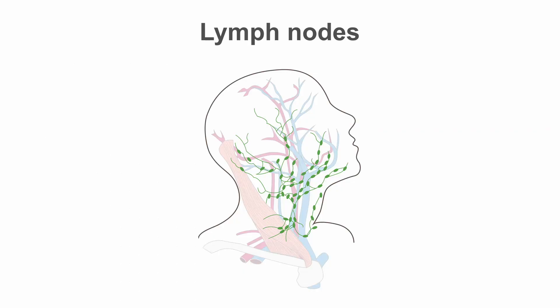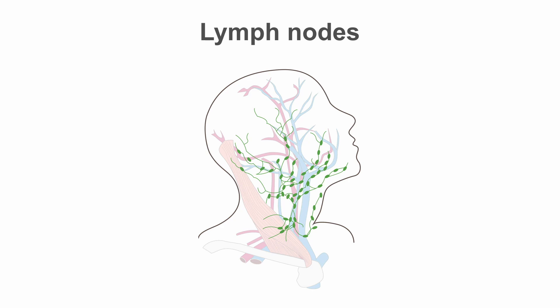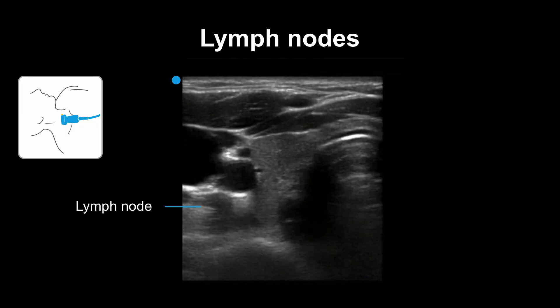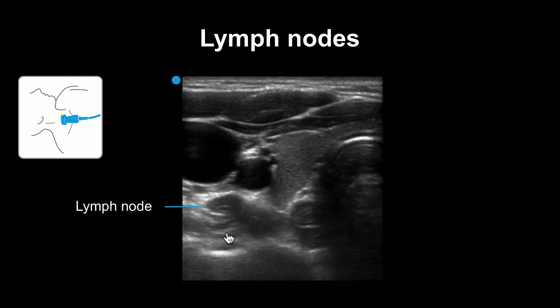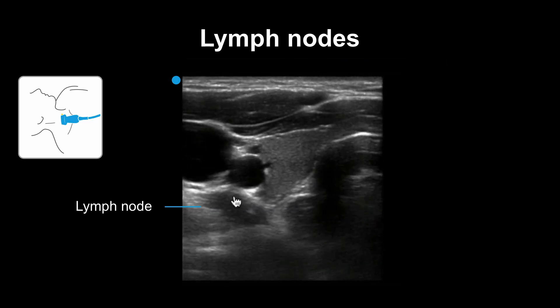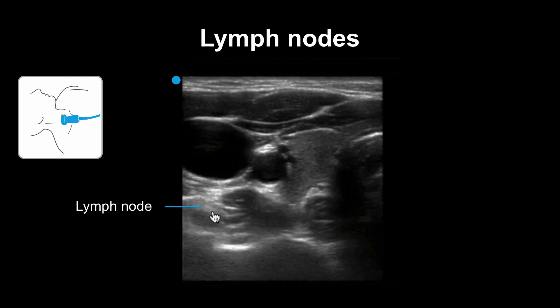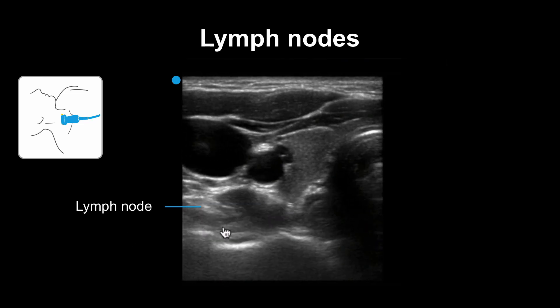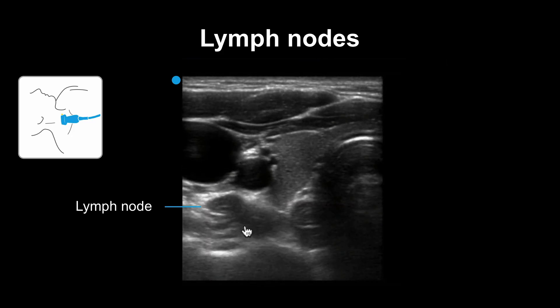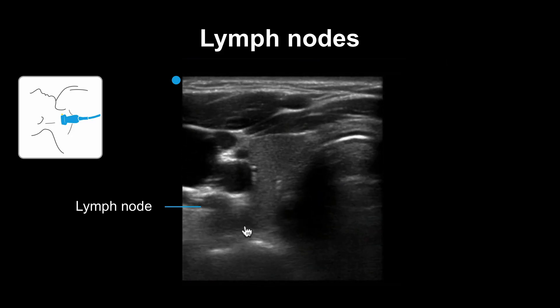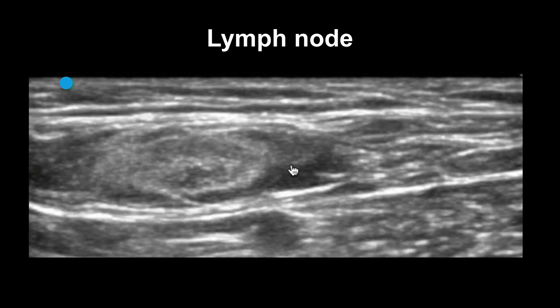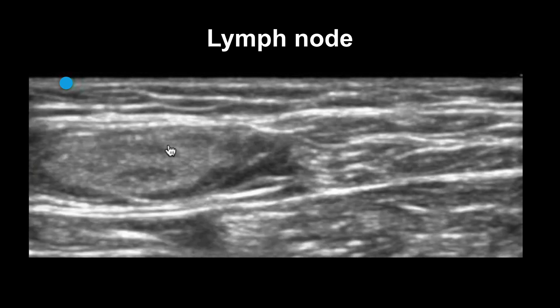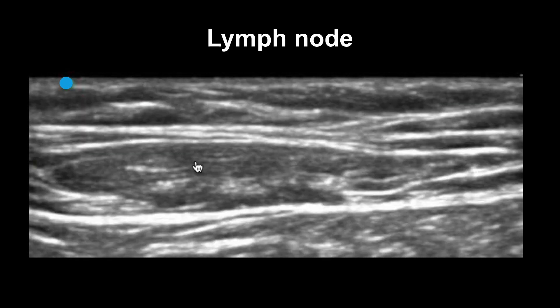There are also several chains of lymph nodes in the neck that you may encounter. Lymph nodes are rounded heterogeneous structures that are blind ending — here you can see one behind the left IJ. Here is another example of a lymph node: rounded and blind ending.